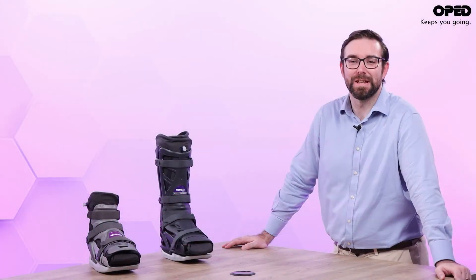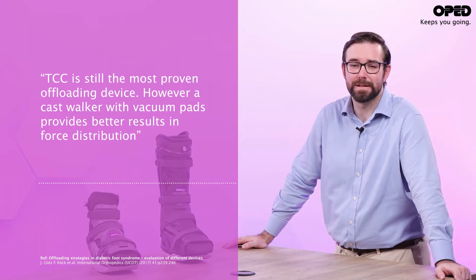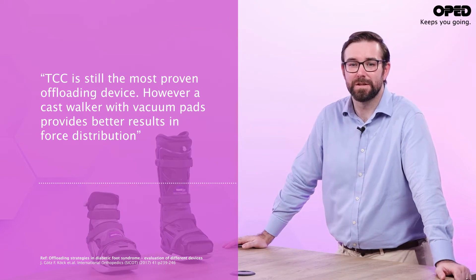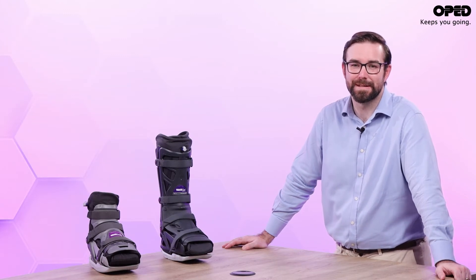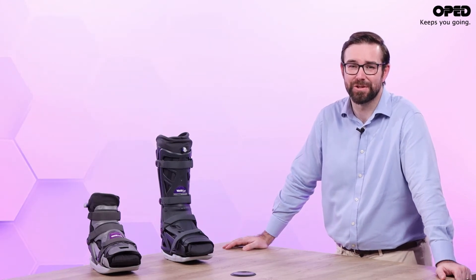This total contact technology is proven to be as effective as total contact casting, but faster and easier to apply and adopt in a daily routine. Vacacast Diabetic combines the efficacy of a total contact cast with an ease of application of less than five minutes, and can be fitted even by the patient.